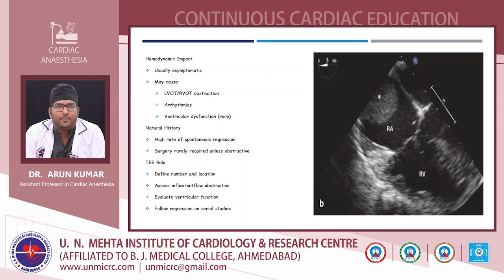When surgery is indicated, the role of TEE is to define the number and location of the masses, to assess any inflow and outflow obstruction, to evaluate ventricular function, and to follow up regression on serial echoes. And this is the same tumor on the mid-esophageal 4-chamber view.